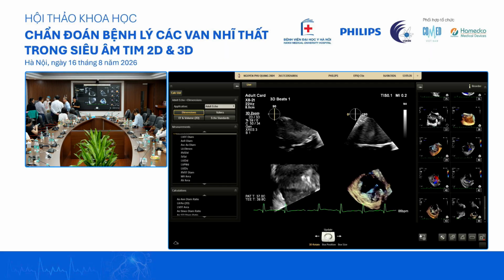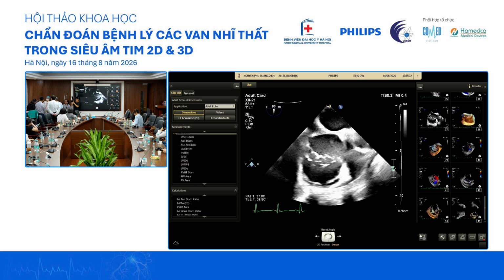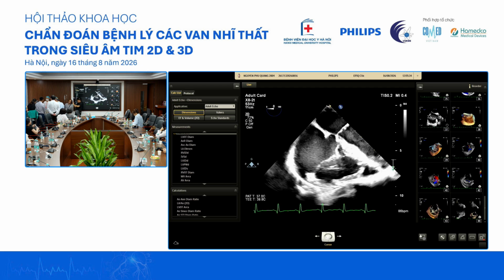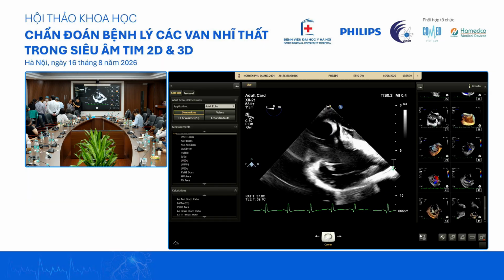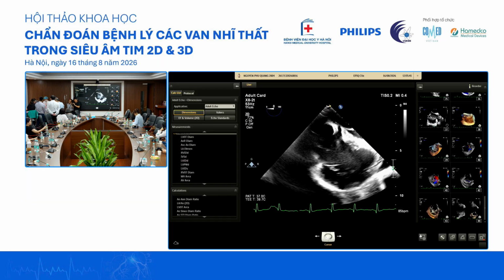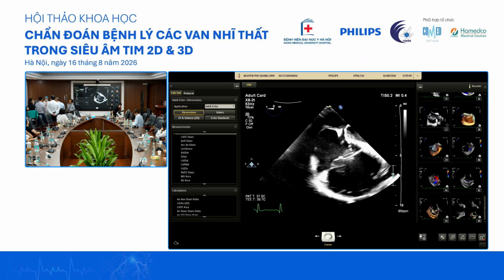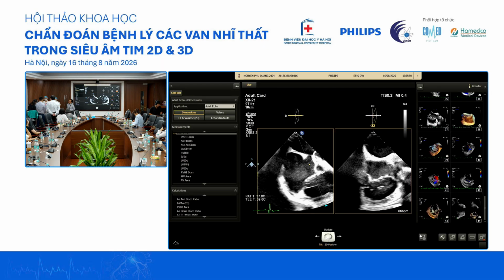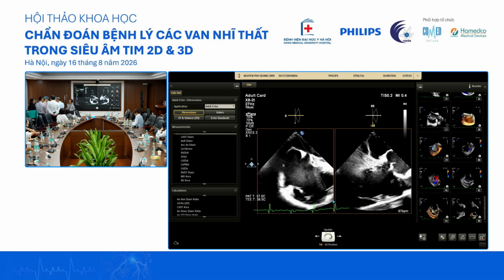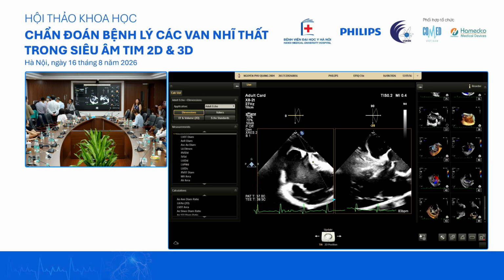the other way is go to four chamber. Yeah, go 4 chamber view. I just want to make sure that you see the septal looks really deficient, very short. And the anterior looks very long, and a bit restricted also. This one is very short. This is anterior. So you have a very short septal. Septal is short.